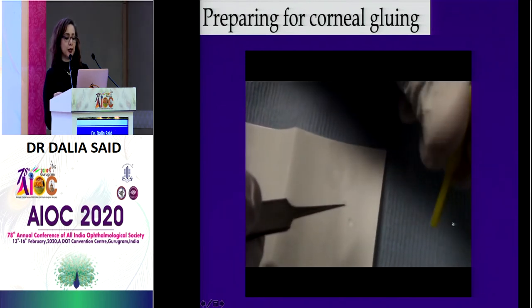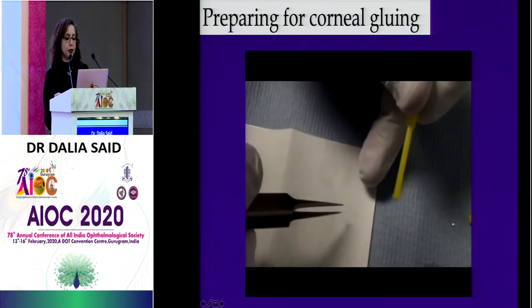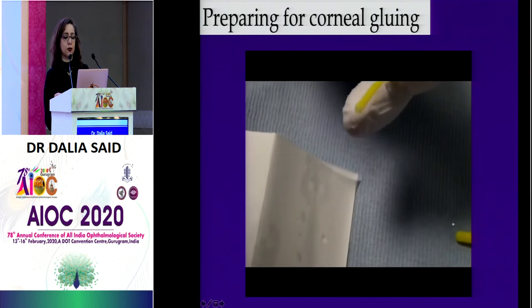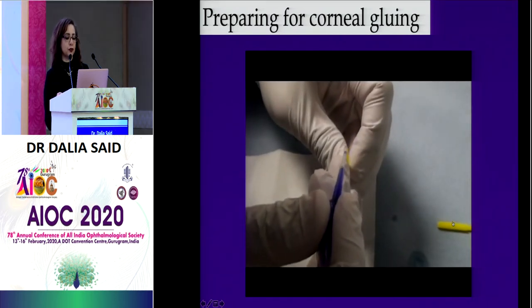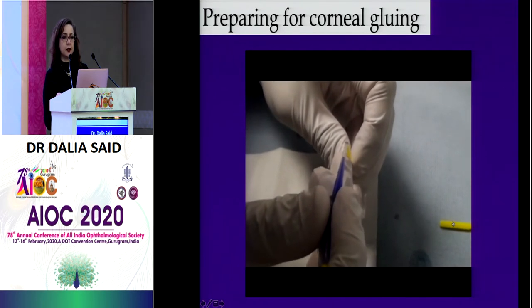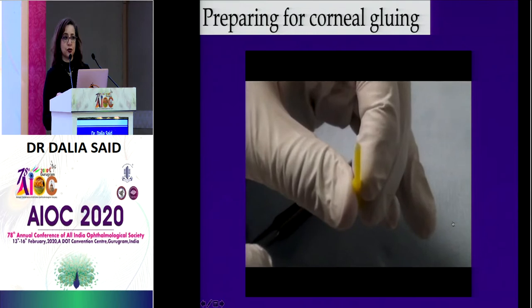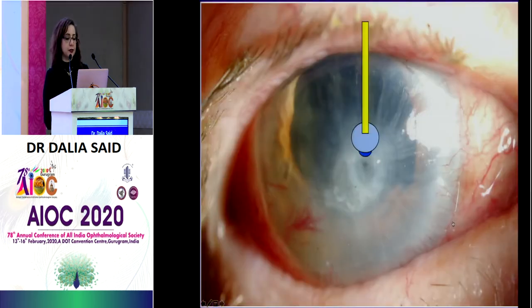And we put a tiny bit of gel or chloramphenicol just to help you take the plastic and put it on the stick, which you've created. Then put a tiny, tiny bit of glue. If you see the glue, it's too much. You can use the edge of the spear to remove the excess, because you don't want to put excess glue. And this is how we do it.